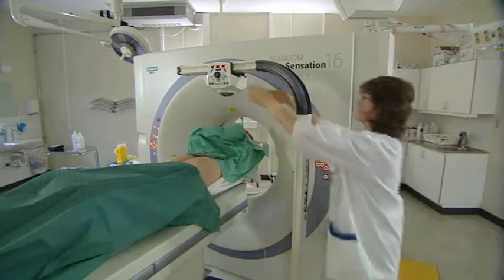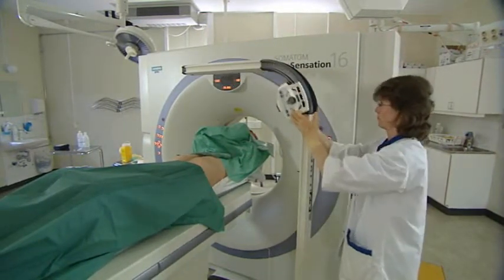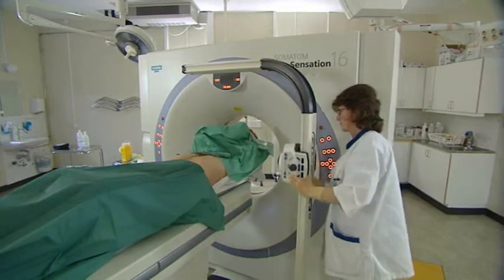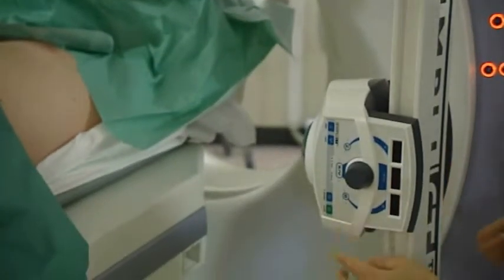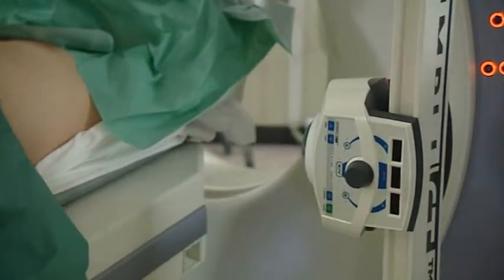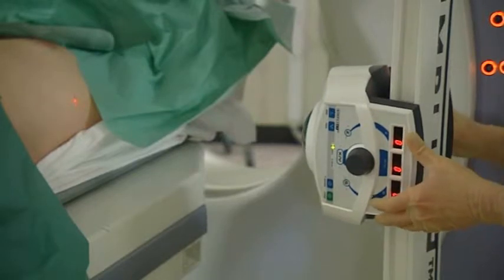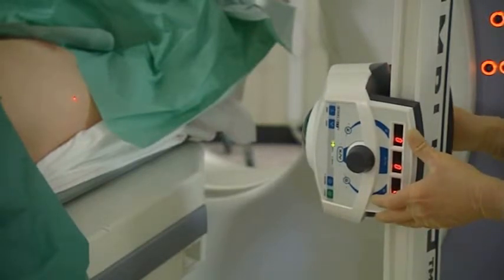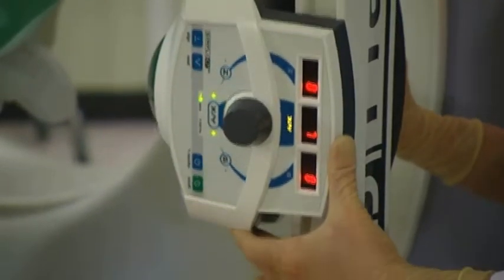When preparing for a lateral procedure, first align the unit with the edge of the table, then slide the laser head down to the vertical rail by releasing the brake handle. In this position, the SimpliCT can be used for any lateral procedure, allowing the patient to be in the most comfortable and stable position. The SimpliCT can be angled 45 degrees to either side, and as such can accommodate for any entry angulation, covering 270 degrees around the patient.